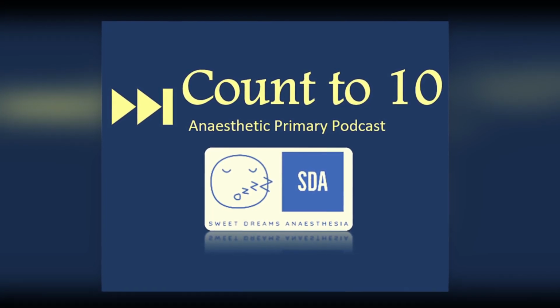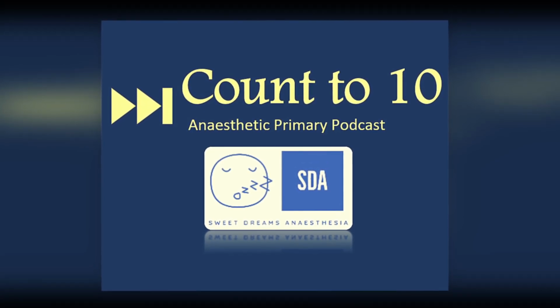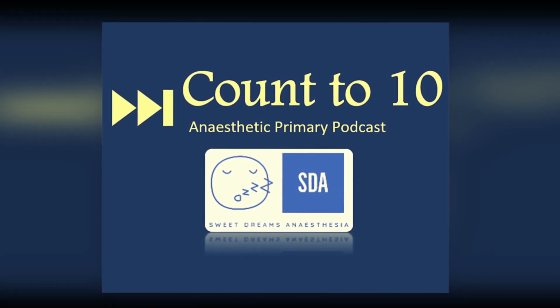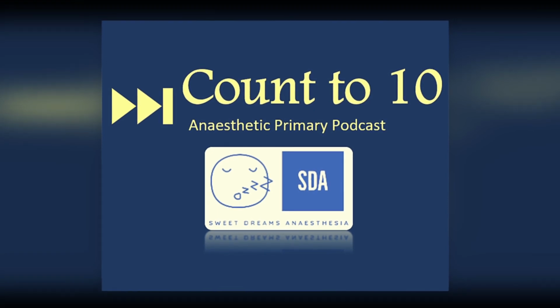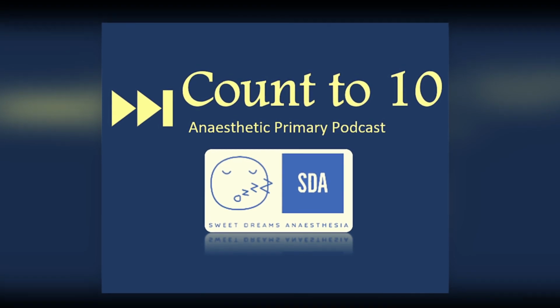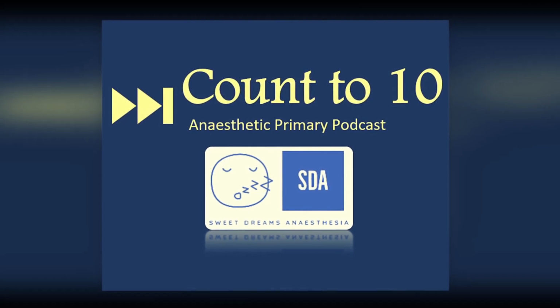Now, when we put these together, we can then say the intensity of light transmitted through a transparent substance decreases exponentially as the concentration of that substance and the distance traveled through that substance increases. We can also attach a mathematical equation to absorbance itself and say that absorbance is equal to the concentration of the solution times the distance of the light pathway times the differing absorbing profile of the individual substance. This differing profile is the second important principle to know when we talk about the pulse oximeter.